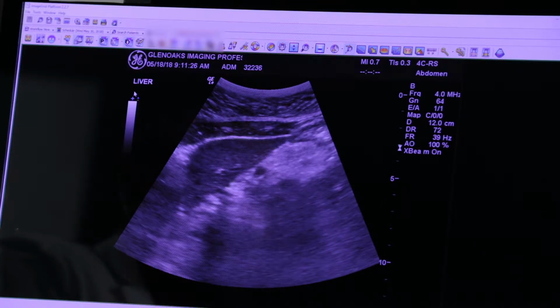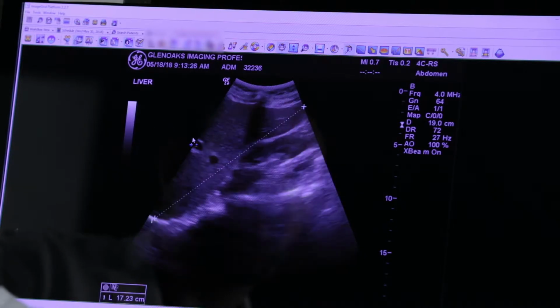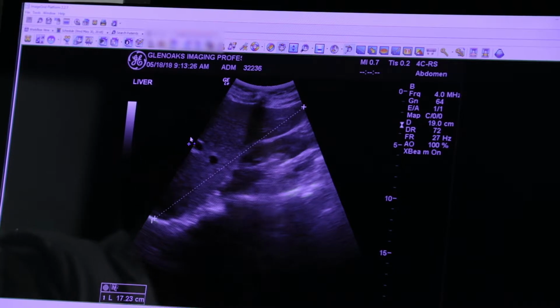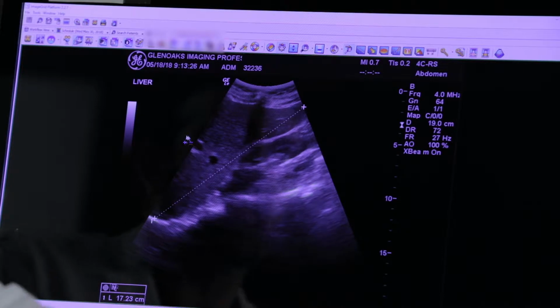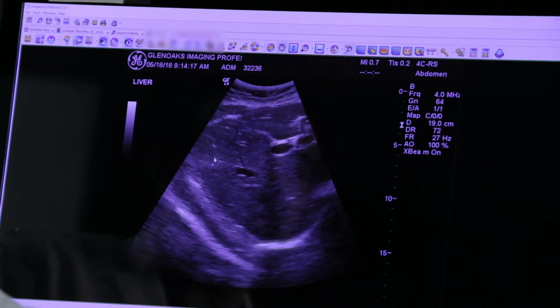In the last 20 years, they use ultrasound as a perfect tool for any kind of diagnosis for any part of the body. Ultrasound uses sound waves, which go through the body and get an image of a solid organ. Soft organs, such as the intestines or lung, are not diagnostic for ultrasound. But for ultrasound, it's the liver, mainly in the abdomen, the liver, kidneys, and gallbladder.